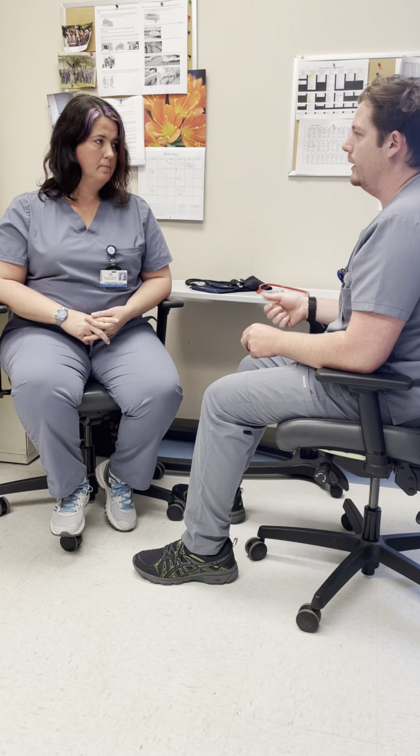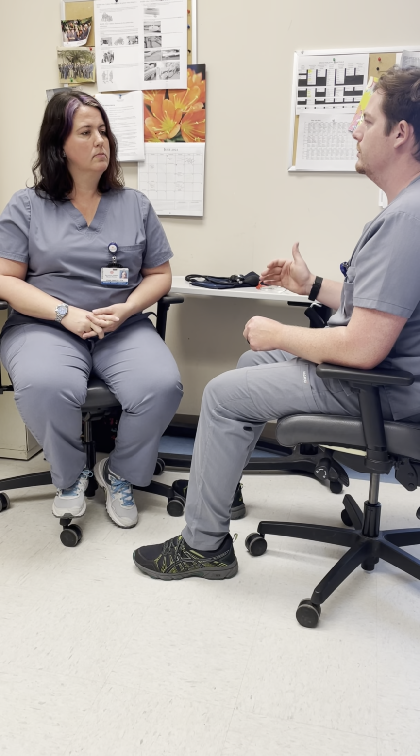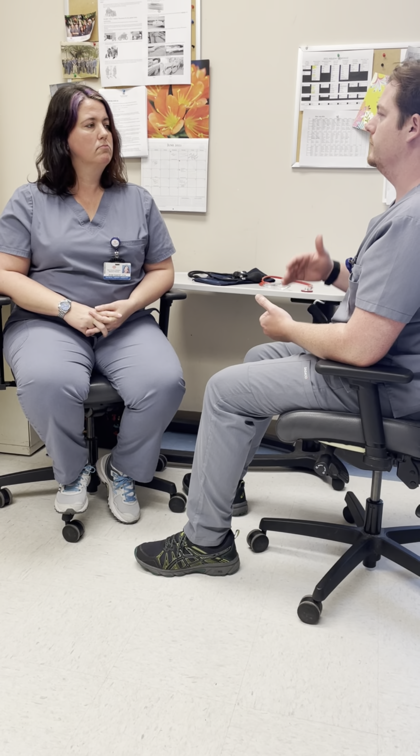Whenever I can't hear it beat anymore, that's where our occlusion point is. So when we take the blood pressure, we're going to start up 20 to 30 millimeters of mercury above that, so that when I take it again, that's where we will begin, and then we'll come back down slowly. All right. So I've already cleaned these off prior to, and I'll be cleaning them afterwards as well.